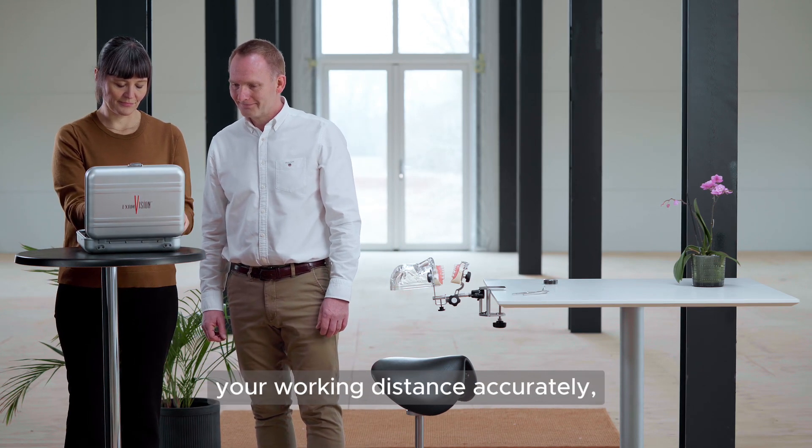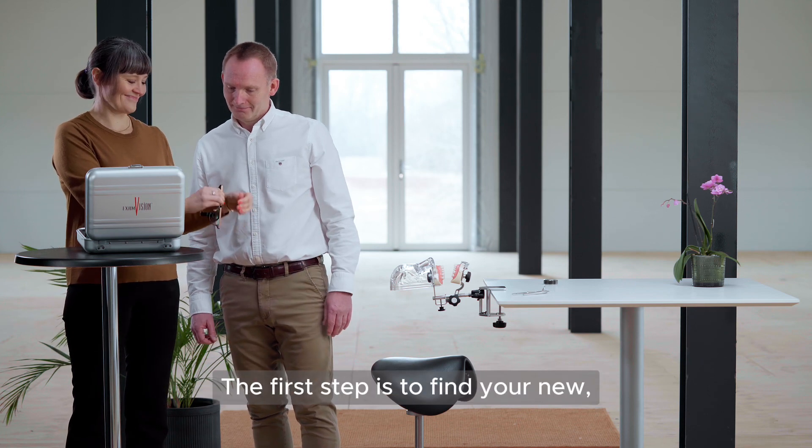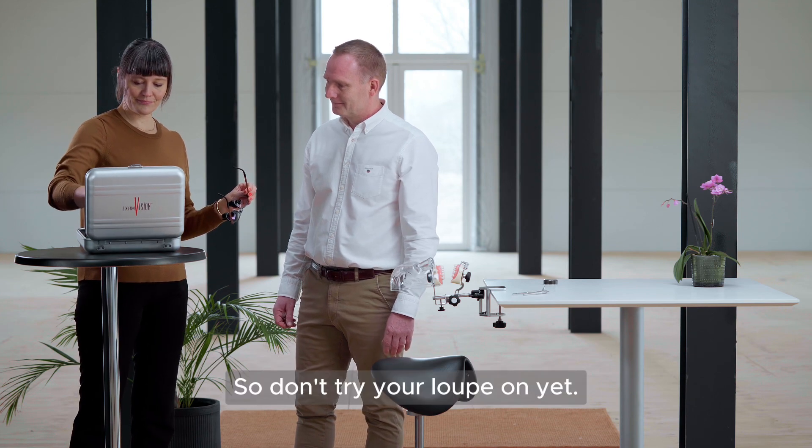You will need to measure your working distance accurately, so please ask someone to help you. The first step is to find your new improved ergonomic position, so don't try your Loop on yet.